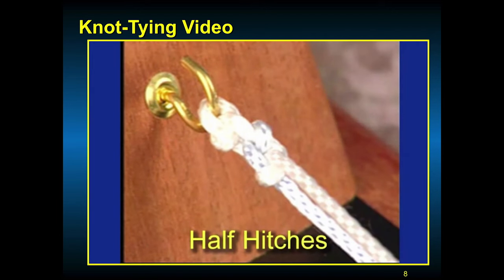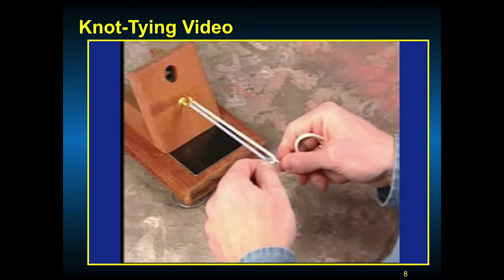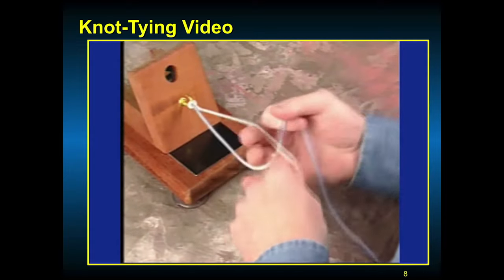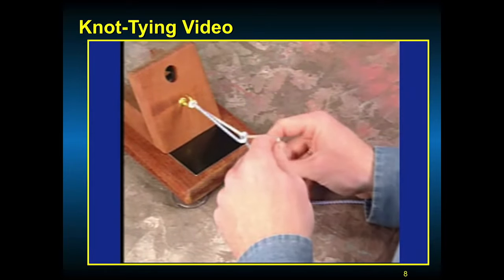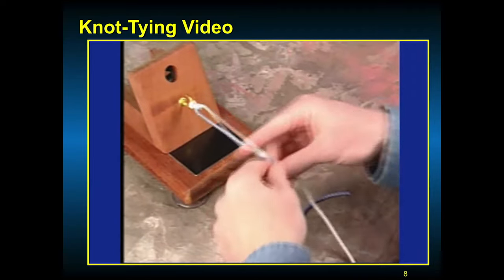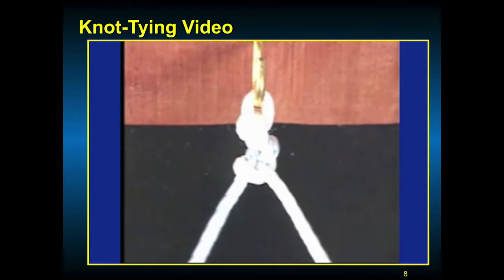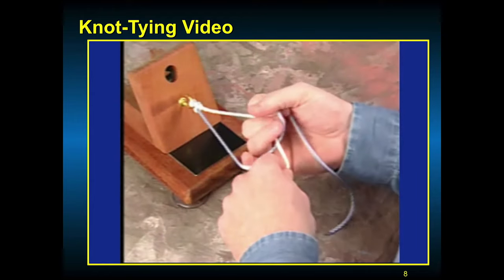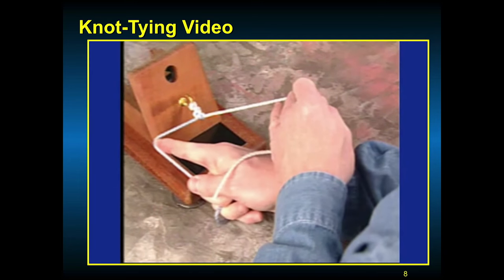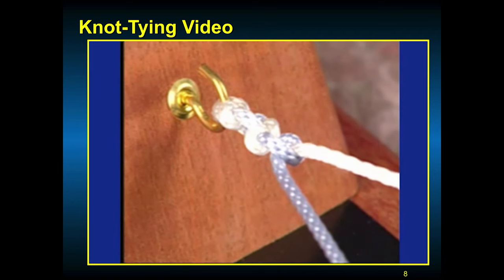This is a demonstration of alternating half hitches, which are very important in knot tying. First, a half hitch is thrown, either overhand or underhand depending on the knot. Subsequently, an alternating half hitch on an alternating post is done and slid down into the joint, securing against the first. You again alternate your post and do a half hitch in the opposite direction from the previous. Three half hitches allow for good security. The demonstration emphasizes alternating posts while alternating the throws of half hitches, demonstrating good half hitch knot tying.